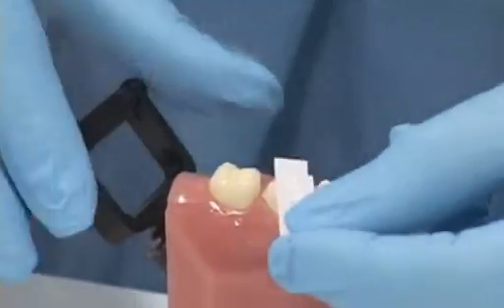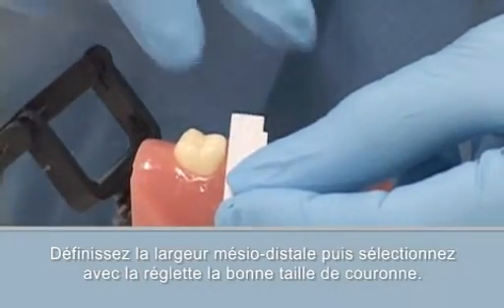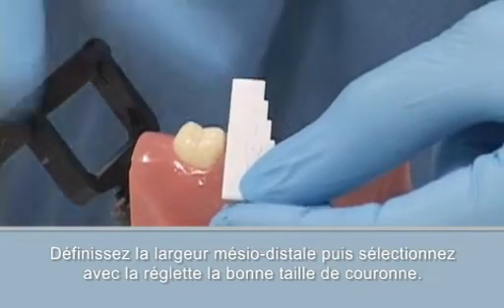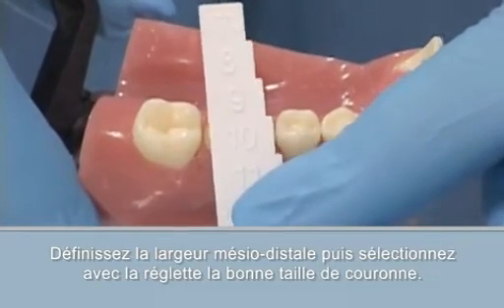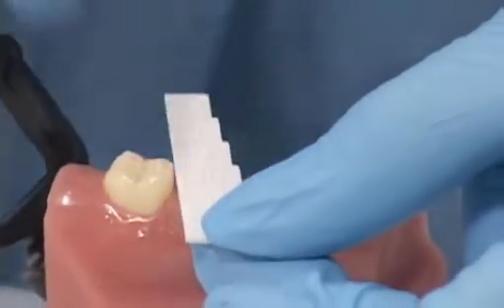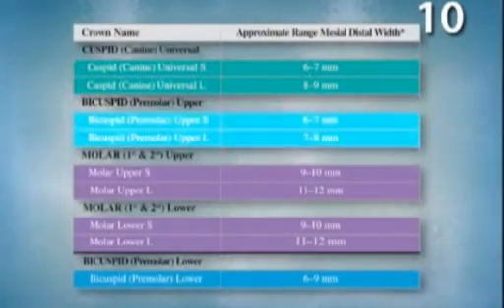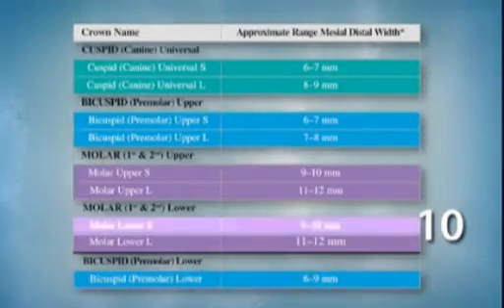I'll tell you, in my practice I really don't use this ruler, but I would suggest that for a dental assistant that's starting out making these, or even a dentist, we want to look at exactly how much space we have, or the size. In this case I'll angle it here for the camera just so you can see. I want to look at the distance between the tooth behind our prep and a tooth in front, okay? Once you start making these, after the first two that I made, I was like, I really don't need this ruler anymore. But I think it's good just to get an idea of the size to start with.